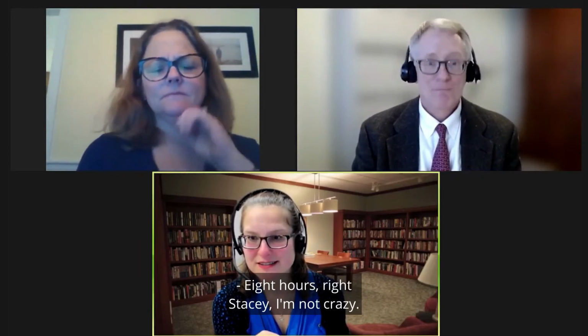Perfect. Okay, so here's a technological question regarding specifically intermittently scanned sensors. How frequently do you need to scan intermittently scanned sensors to capture all the data? How long can those sensors hold on to their data? 8 hours, right, Stacy? I'm not crazy. Okay. 8 hours, yep. Yep, you're not crazy. 8 hours.